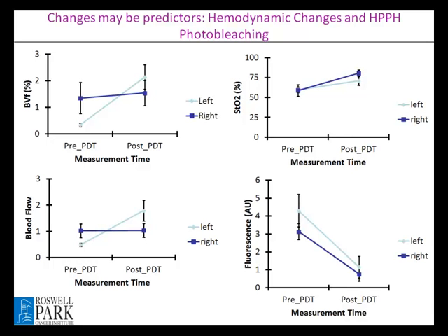But it would really jeopardize the measurements. I cannot really measure the patient 2 hours later and correlate. It is almost impossible. That is one of the problems. And you have the oxygenated and deoxygenated hemoglobin. Yes, I have everything there. We will look into that. All the analysis is done by my student, so I haven't done anything yet. As you saw in the equation, it's more like a bias because we took it from the PDT papers. They generally try to fit blood volume fraction and blood saturation because when you are fitting, we can really say that blood saturation will be between 0 and 1.